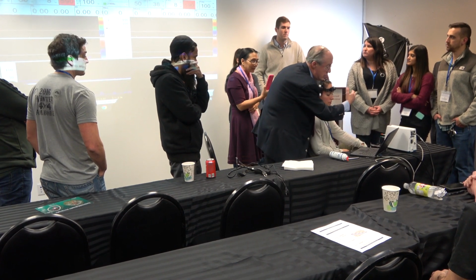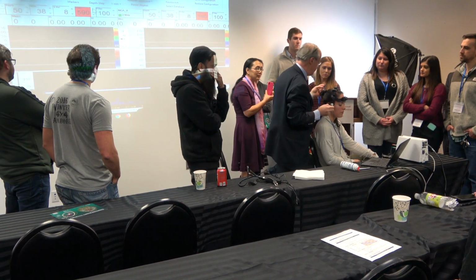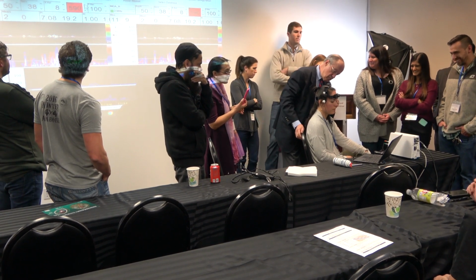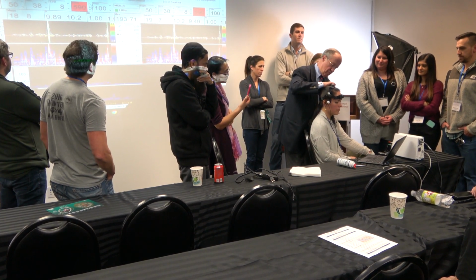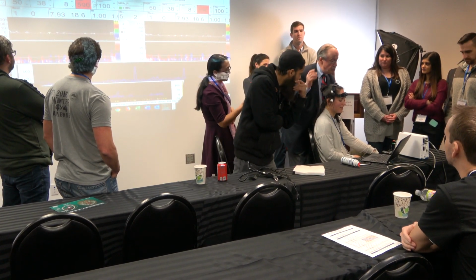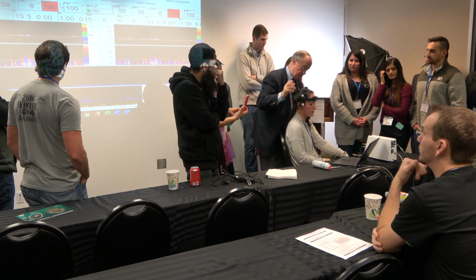So on the left side we are at depth 50, which corresponds to the M1 segment of the middle cerebral artery. Now what we need to do, we need to find the vessel, right? And of course, when you are trying to find the vessel, you need to look at the screen and listen. Because initially what you can start hearing is a pulsating sound.